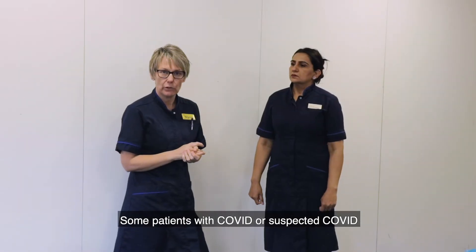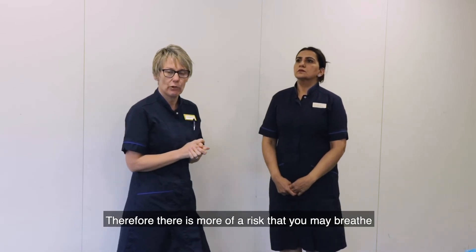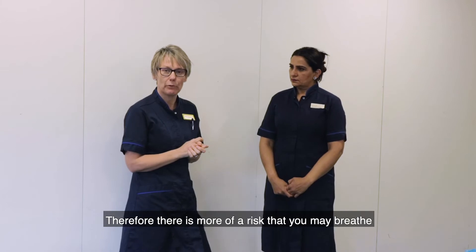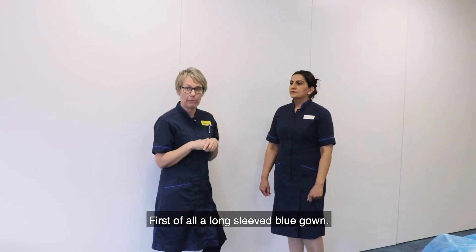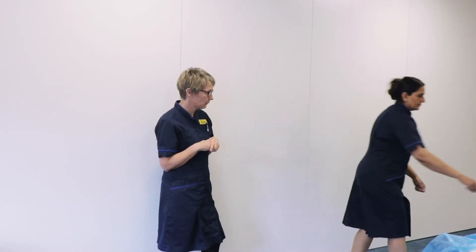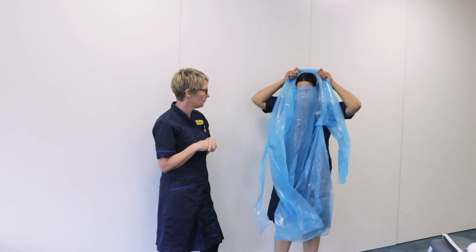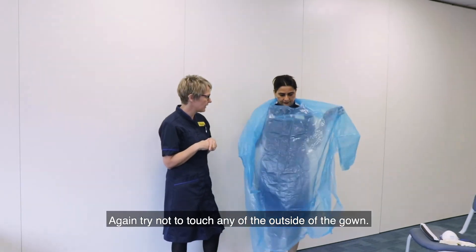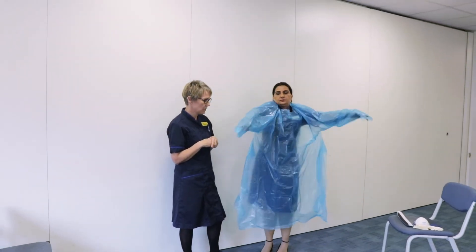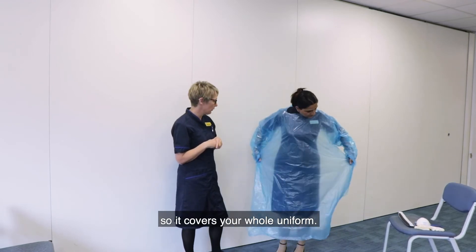Some patients with COVID or suspected COVID will require aerosol generating techniques, therefore there is more of a risk that you may breathe in some of the viral particles. So for this process you need the following PPE. First of all, a long sleeve blue gown. Try not to touch any of the outside of the gown, and please make sure it's secured at the back so it covers your whole uniform.